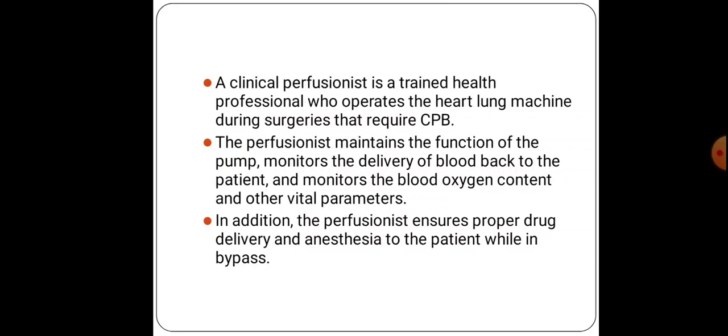in anesthetic mode or in the normal mode, because if they are in normal mode, they can feel the pain. If they feel the pain, then the surgery will not be proper. So the perfusionist ensures proper drug delivery and anesthesia to the patient during the CPB.